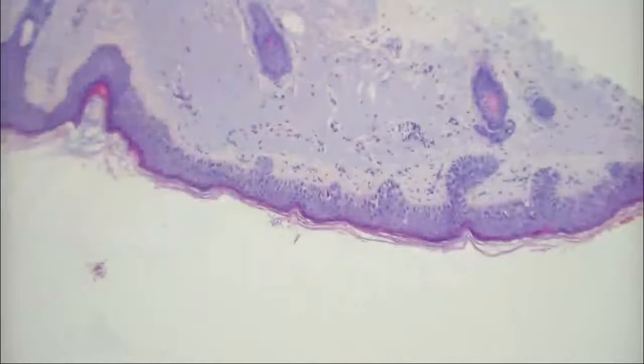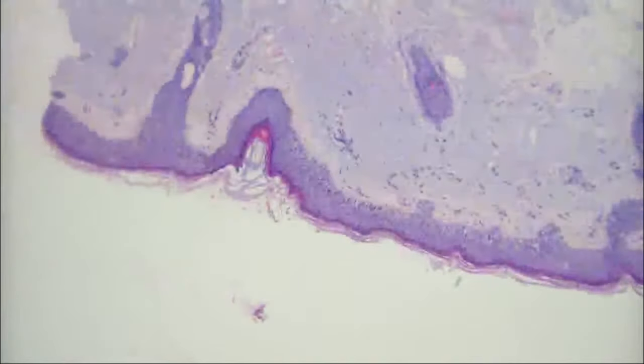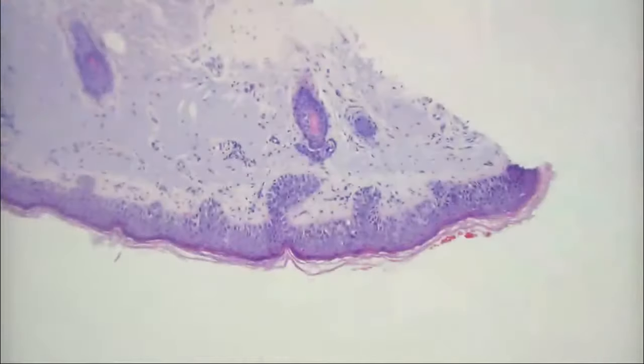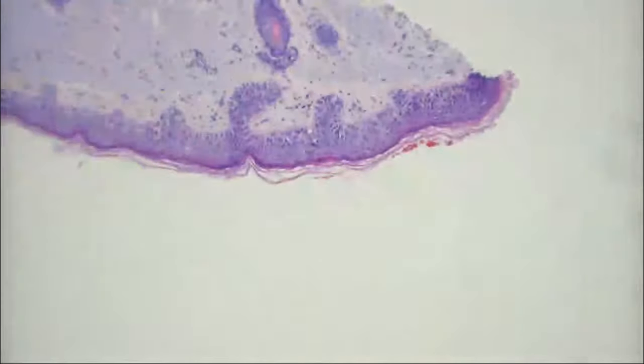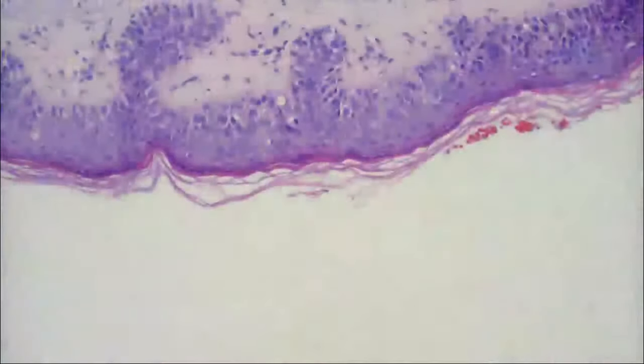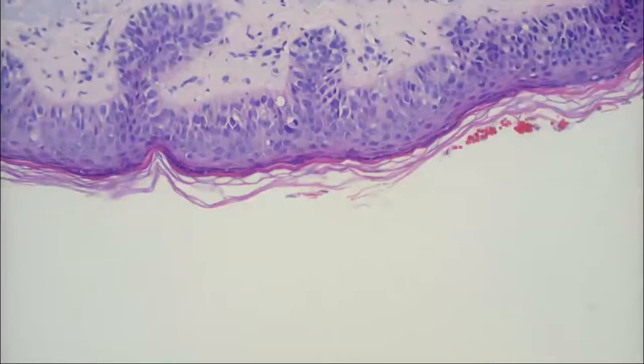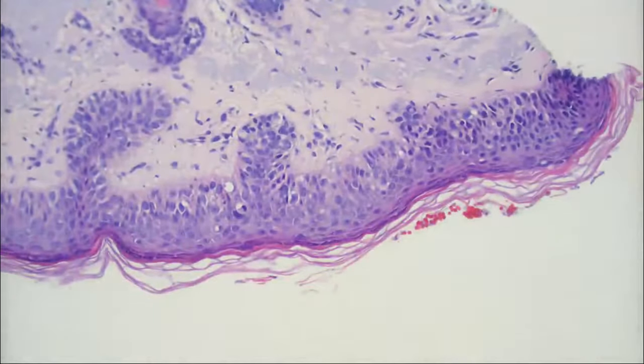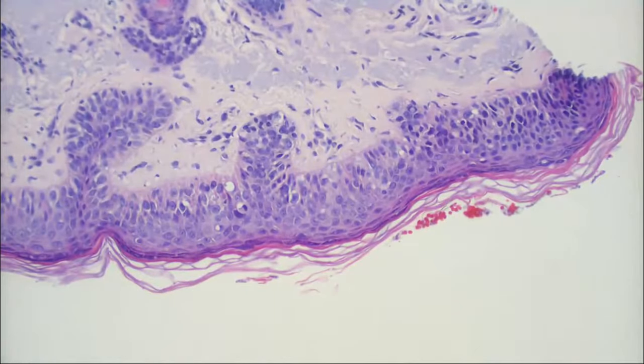I was looking through it. I was having a hard time deciding whether or not it was full thickness or not full thickness. So you thought it was atypical. Do you think it's a neoplasm? Do you think it's benign or malignant? I think malignant, kind of beginning stages of malignancy. Okay, good, excellent. Early stage. Excellent, very good. And what kind of differentiation?